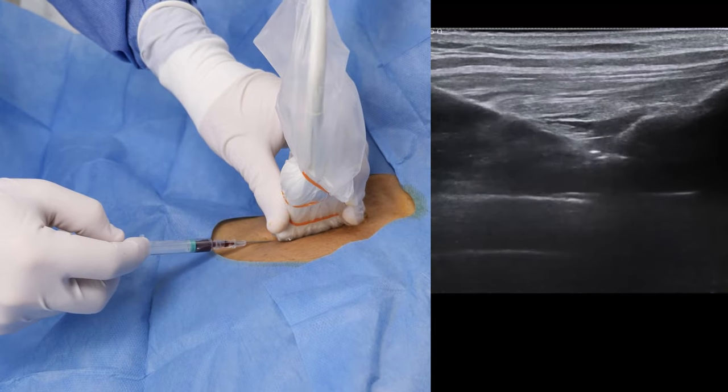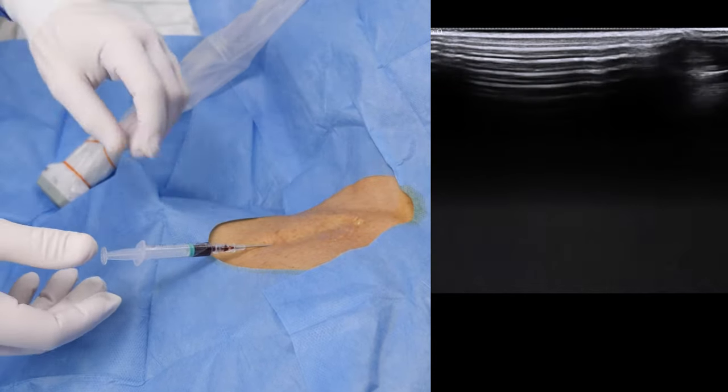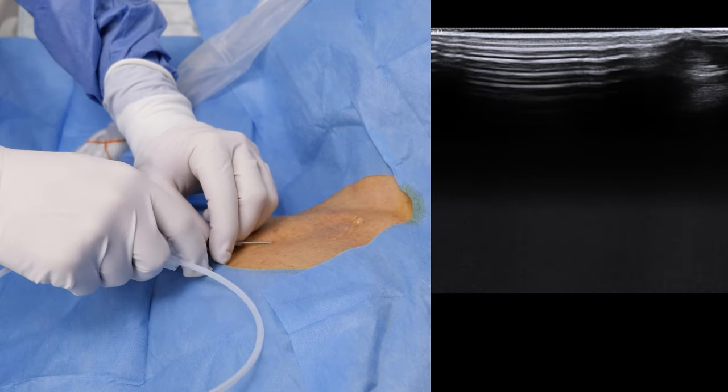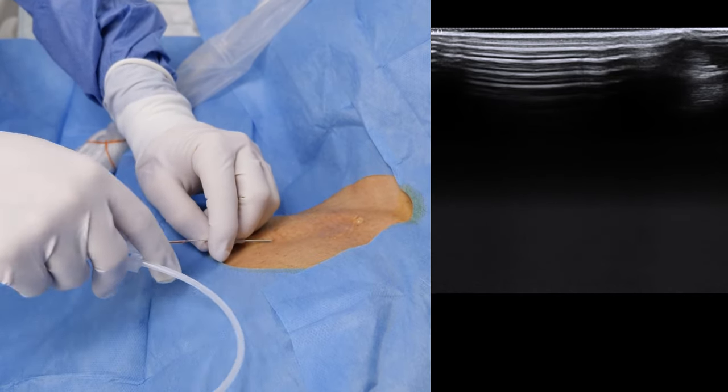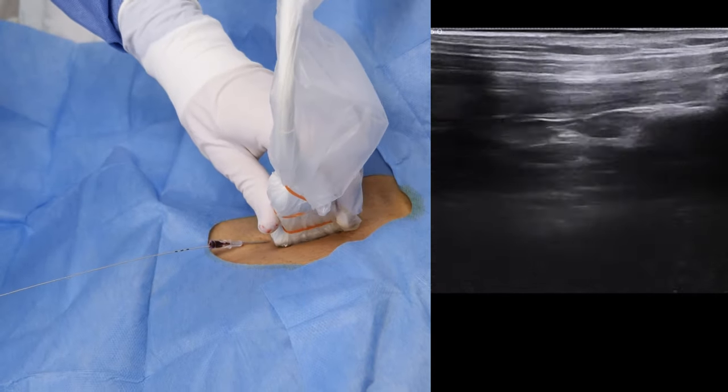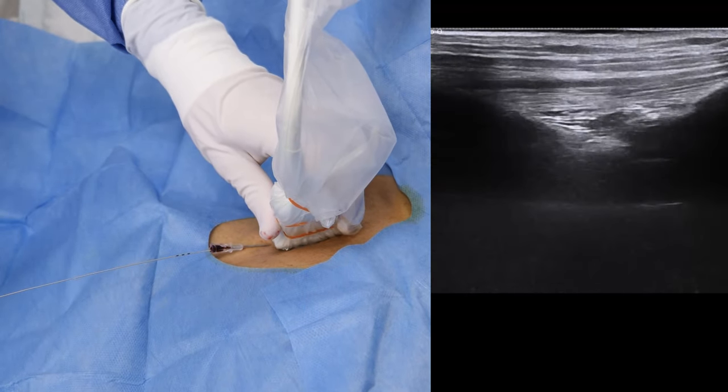Aspiration of dark non-pulsatile blood indicates that we've successfully punctured the vein. Insert the guide wire in the usual fashion, and confirm its correct position by identifying a hyperechoic line in the subclavian vein.